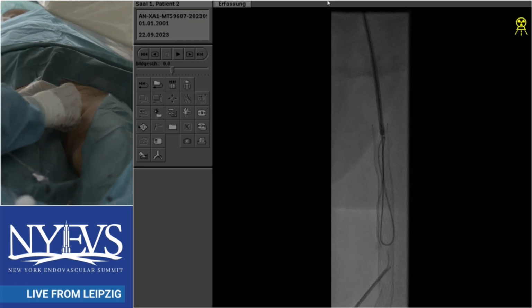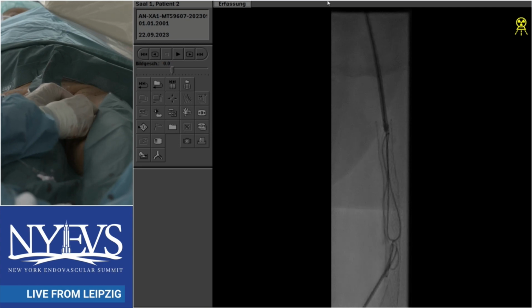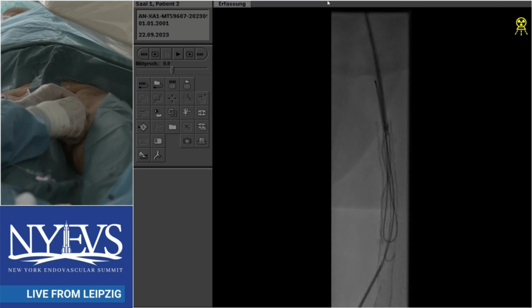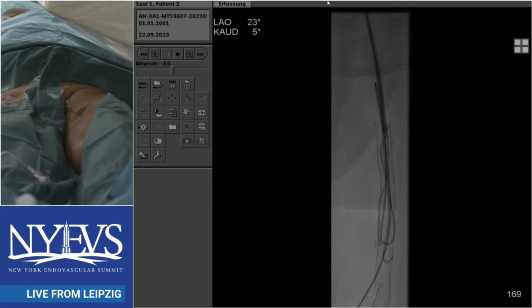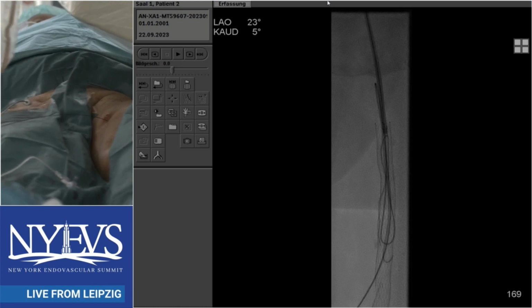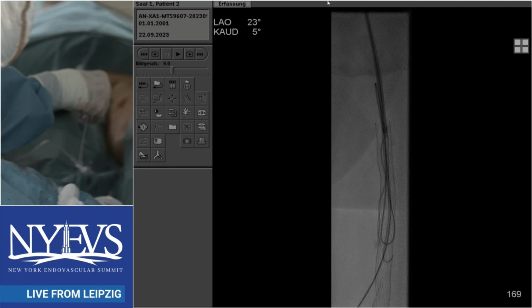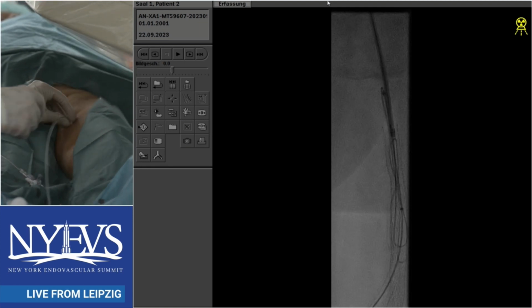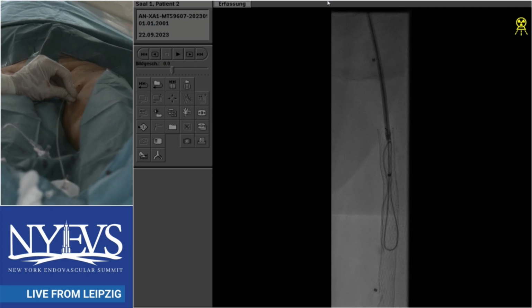Can I ask, though, if this was a CLTI, what would you do, Christian? Most definitely, now you are switching, and now you can live with the consequences of things going wrong when you are attempting a limb salvage procedure. And again, I think this fails times 3. If he presents with recurrent CLI, then I will probably attempt an endovascular rescue, as he has failed already venous bypass. No doubt about it.